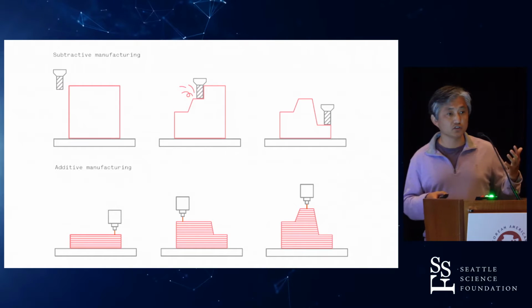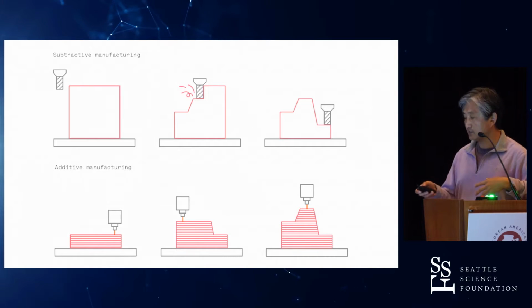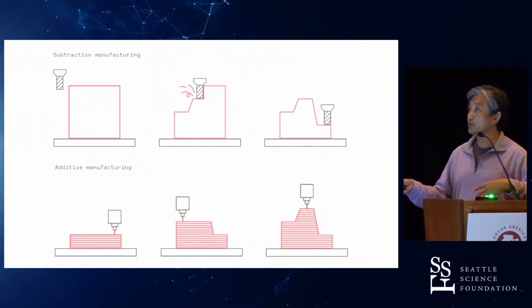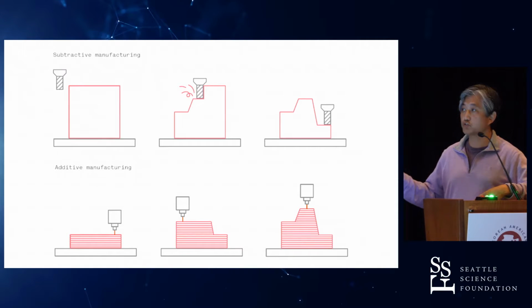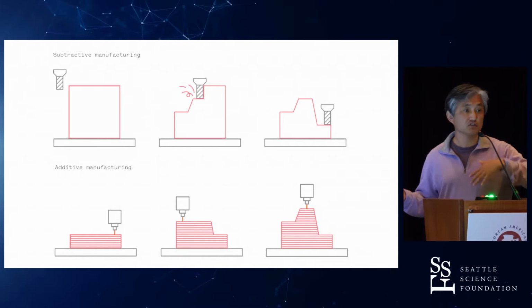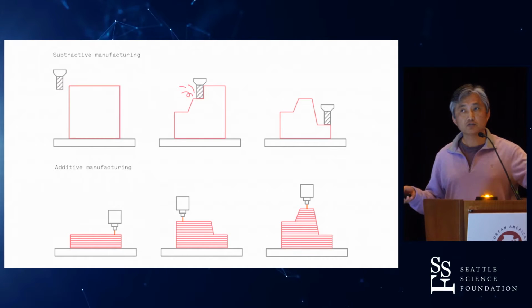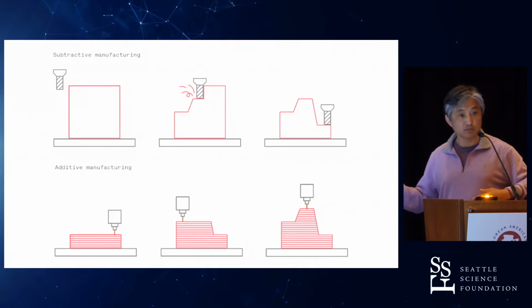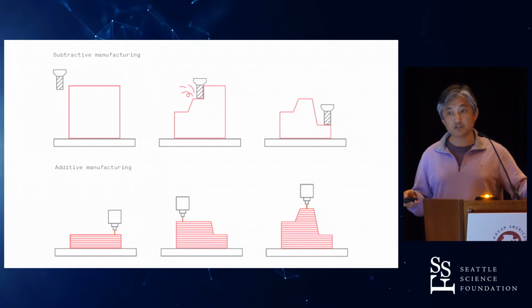Okay, but surface technology is being done today in two different ways, it seems like. You can either take the material, the titanium, whatever it is, and cut it down and change it and alter the surface. Or you can use 3D printing, which is, again, revolutionary, as we know, and there'll be more slides about it, but that's how 3D cages are made, right? You start out with a surface and you add to it and build something on it, which is 3D printing of titanium cages.